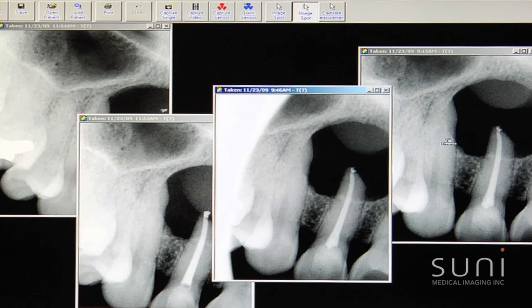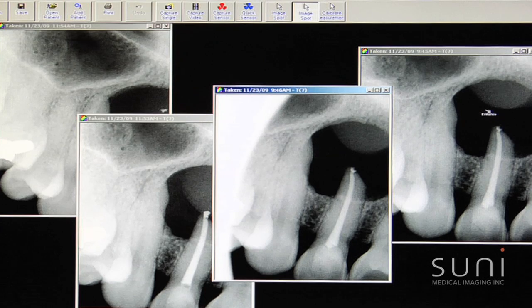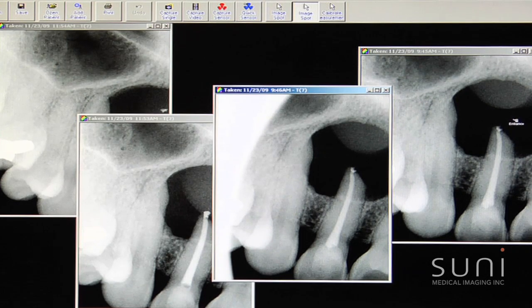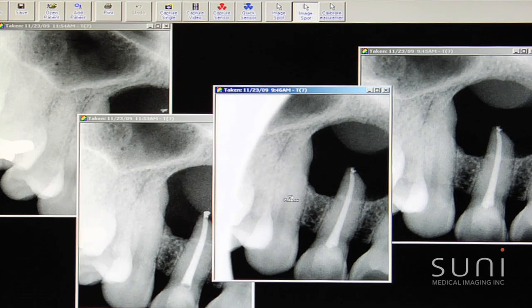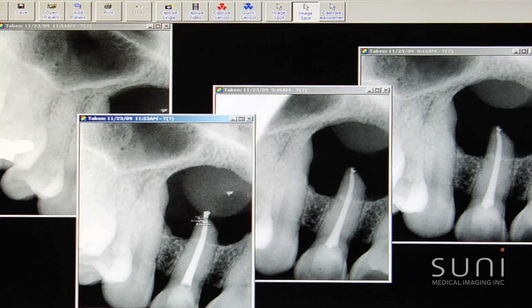What was very interesting about this case to me was that when you see this type of lucency that's so dark, we automatically assume that it's a through-and-through lesion. In fact, it was on the palate, but not on the facial, as we'll see in just a second.